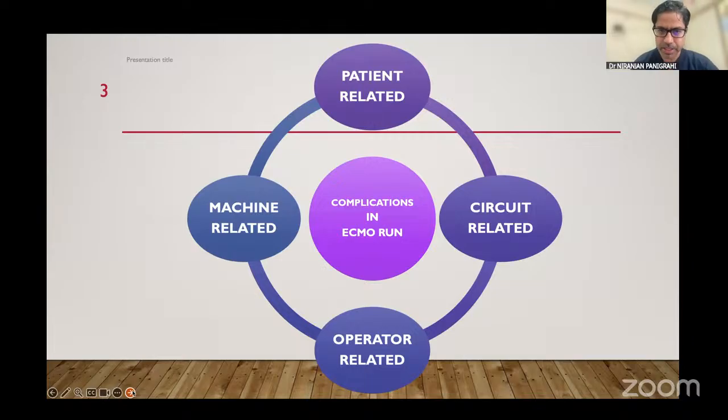The complications with the machine in a patient can, to start with, be patient related. Many times, a compromised lung or compromised heart carries a different dynamics and physiology compared to normal lung or heart function. So we have to have a very good understanding of the patient and the patient-related problems, as they can very well create problems or generate alarms.